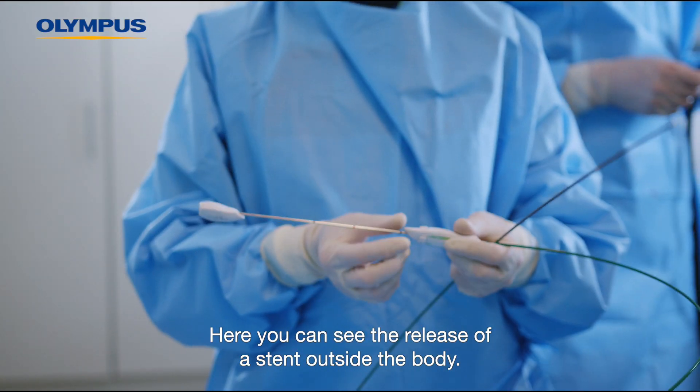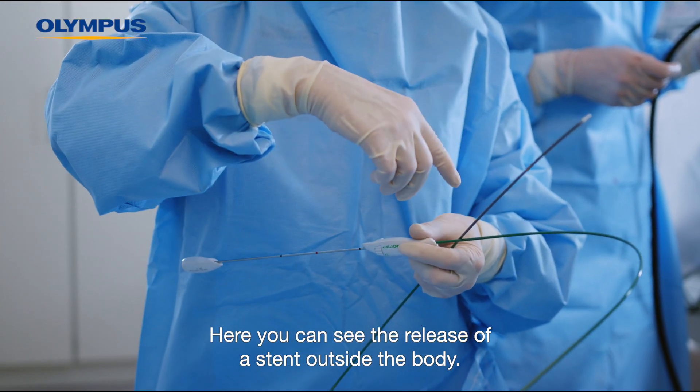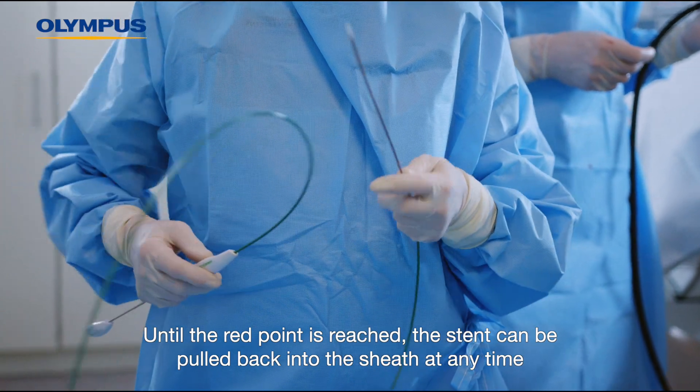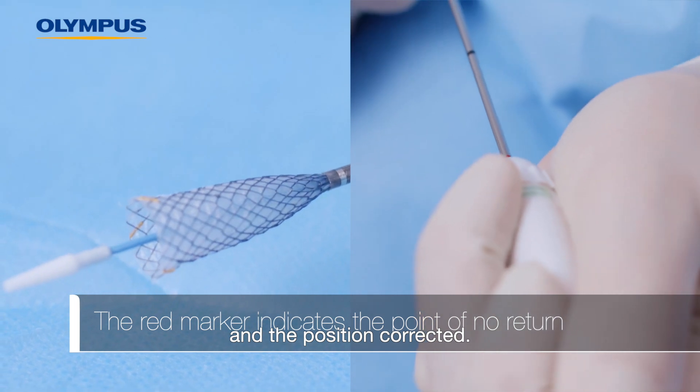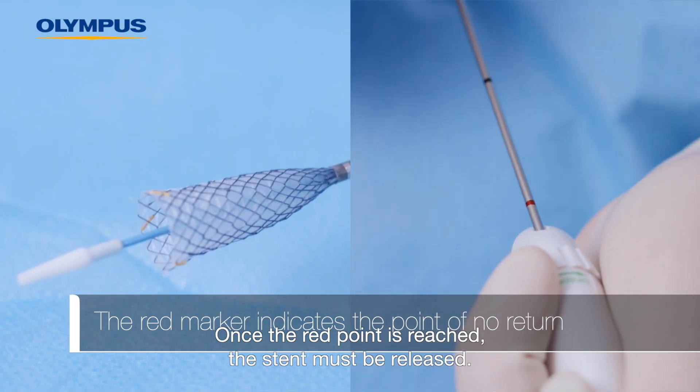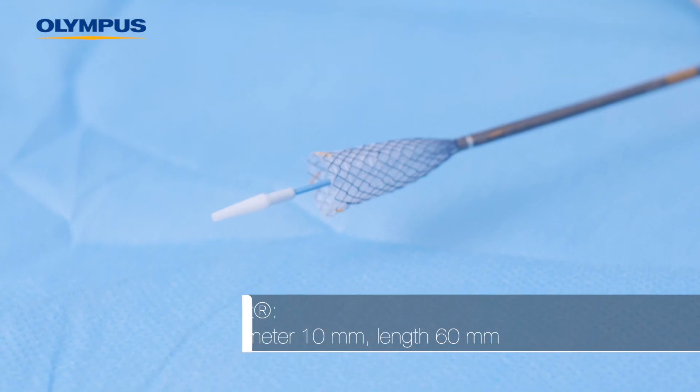Here you can see the release of a stent outside the body. Until the red point is reached, the stent can be pulled back into the sheath at any time and the position corrected. Once the red point is reached, the stent must be released.